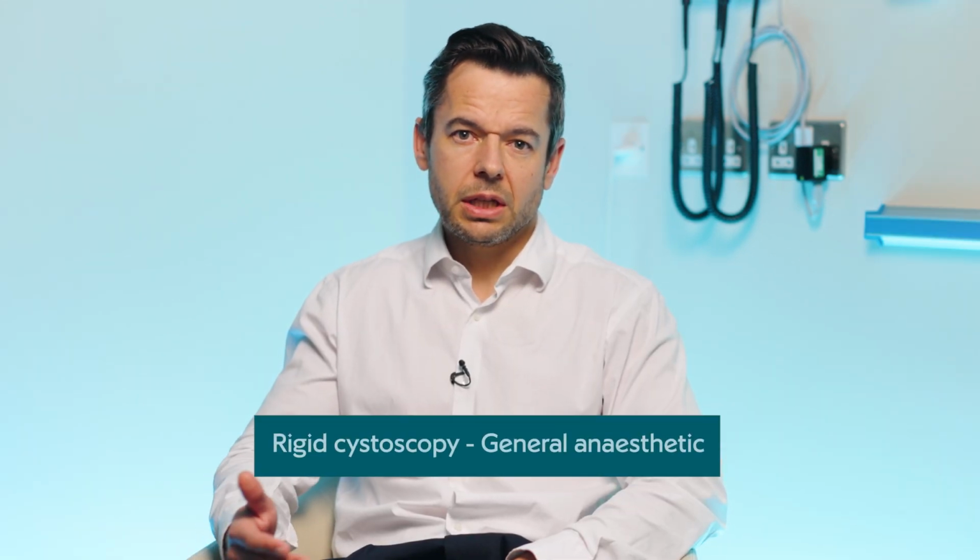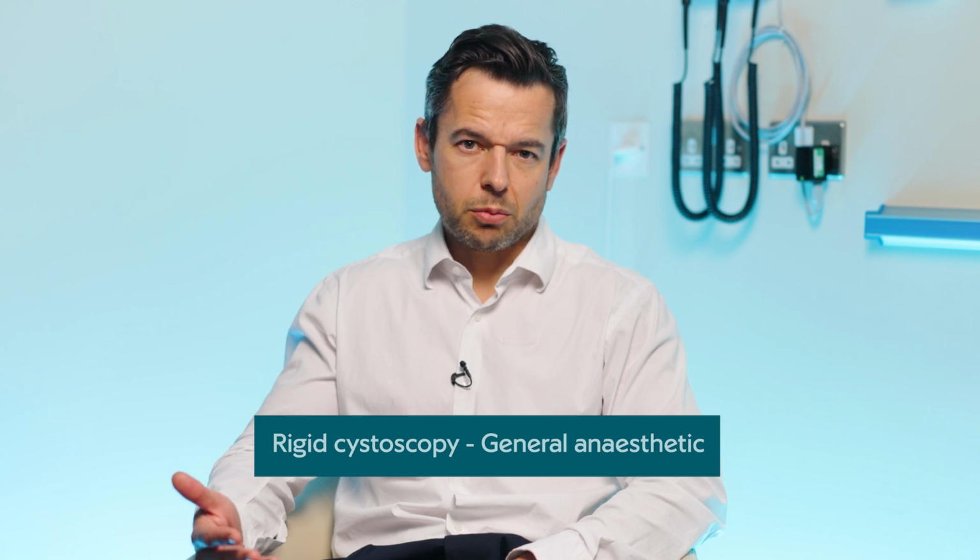When it's done under general anaesthetic, the instruments are slightly larger. There can be more incidents of blood in the urine. Usually under general anaesthetic, an antibiotic is given to minimise the risk of infection. And if any procedures are undertaken within the bladder, whether that's taking biopsies or removing growths from within the bladder, there's a small risk of injuring the bladder or the urethra during that procedure and needing further treatment to repair it. The results of any tests will then be discussed with patients later on, and plans made for any further treatments that might be necessary.